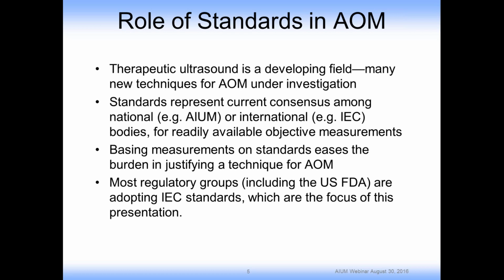So basing the measurements on a standard technique eases the burden in justifying a technique for AOM, for example, in terms of reviewers. You can certainly have other measurement techniques, but when you refer to a standard, it's easier to justify, and you can just refer to that standard instead of having to explain the exact protocol that you use to characterize the acoustic output. Most regulatory groups, including the US FDA, are adopting IEC standards, which is why that's the focus of this presentation.